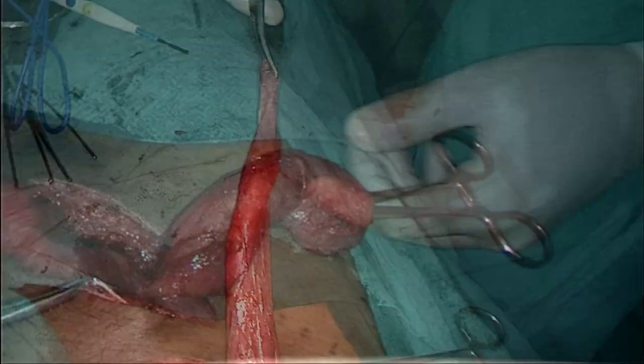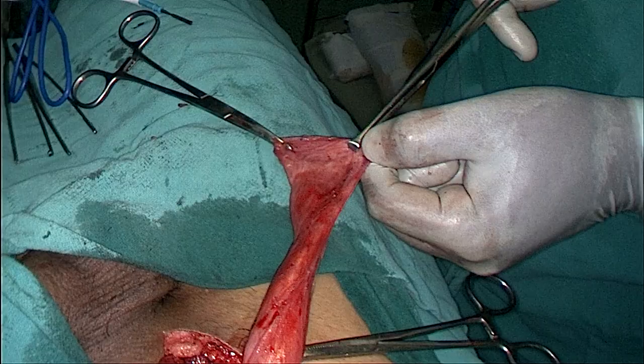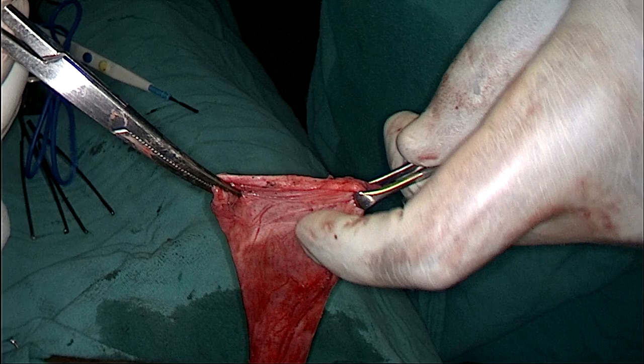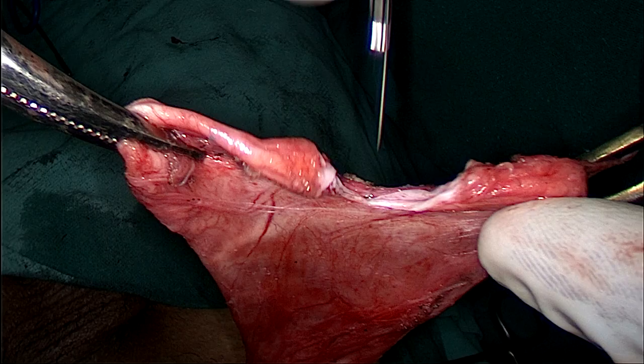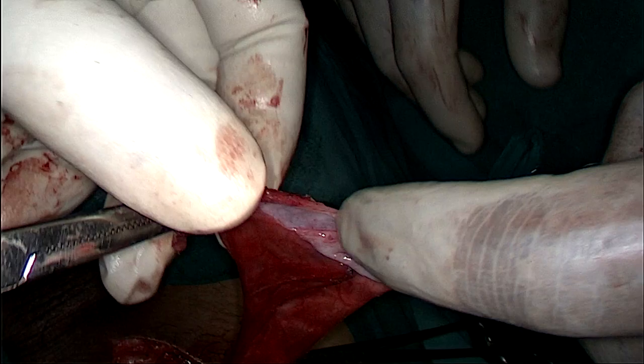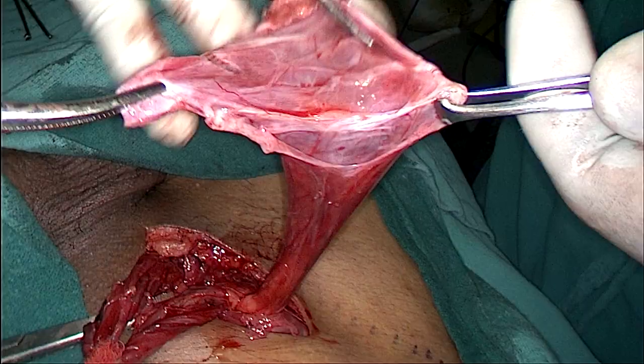Now isolating again and starting work on the sac. I am holding the sac with the artery forcep and will start cutting down the sac from top to bottom. Now giving a nick with a scalpel and holding the edge of the sac with the artery forcep. That is the peritoneal fluid — hope you can appreciate it. Now we are cutting down the sac up to the bottom, reducing any content from the sac.